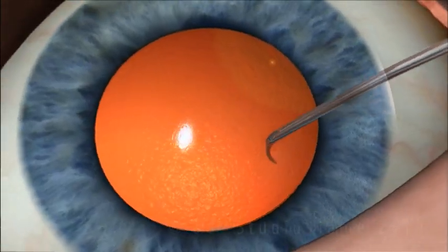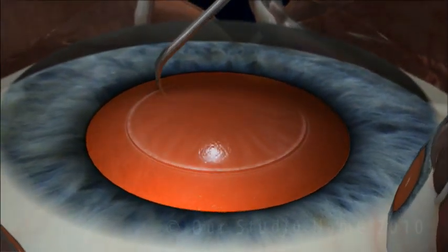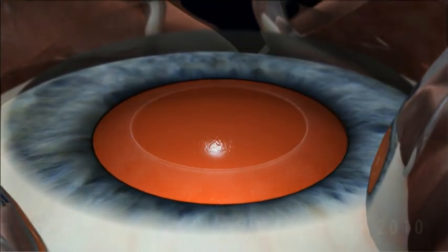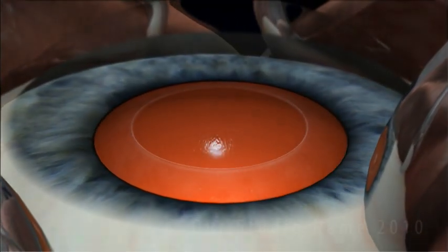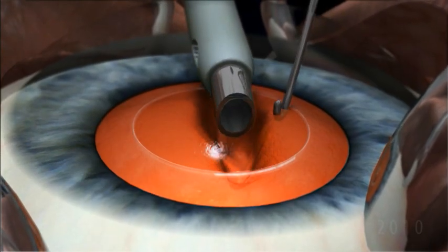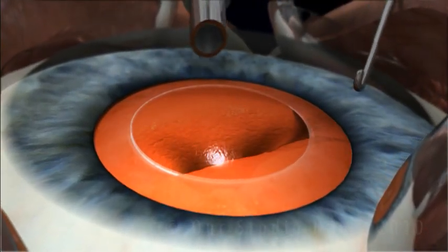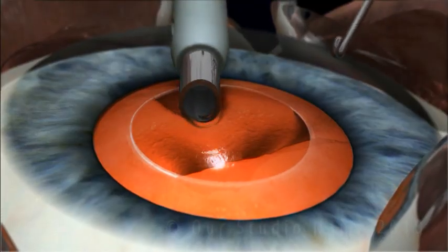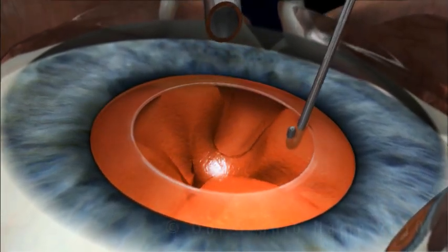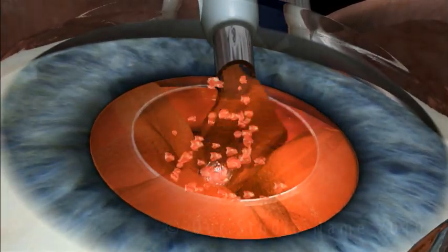The top of the lens capsule is then removed to gain access to the cataract. The surgeon then uses ultrasonic waves to fragment and emulsify the clouded portions of the lens. They are then removed.